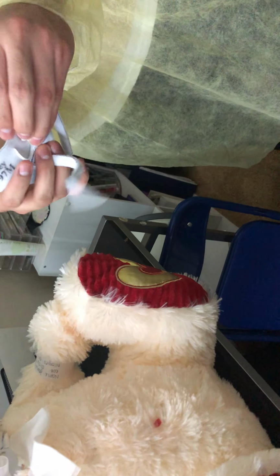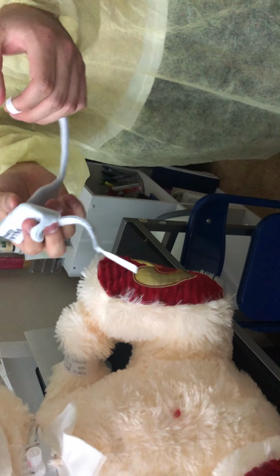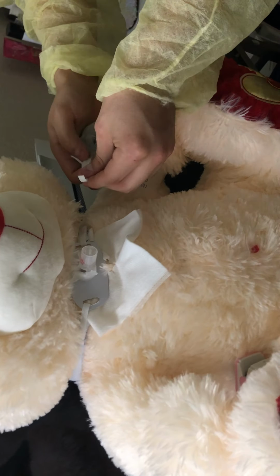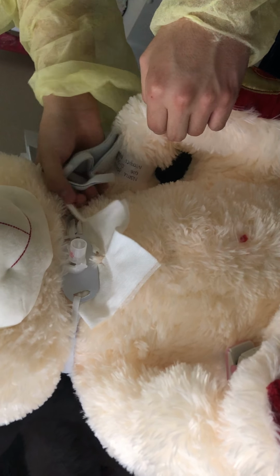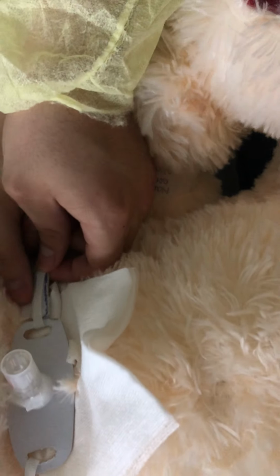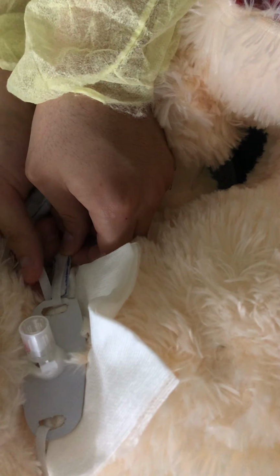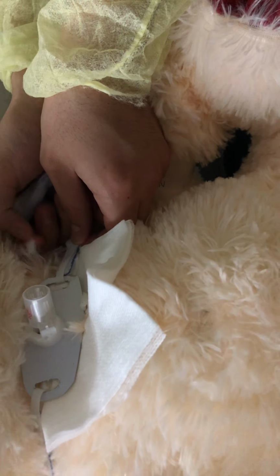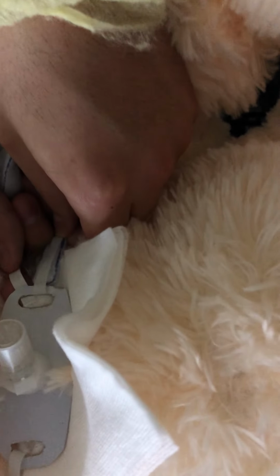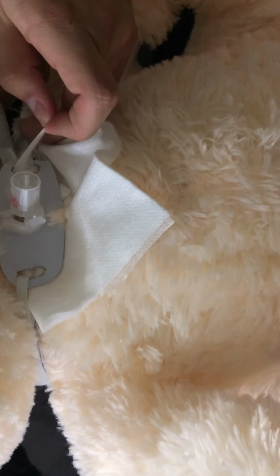My CNA brought it. Open it up. Take it out. Make sure it doesn't touch anything. Make sure I'm careful with it. You can freely touch it because I have gloves on, but at the moment I don't have any real gloves, so I'm pretending. Now I'm going to put it underneath here. Make sure I don't move it too much because I want it stabilized.